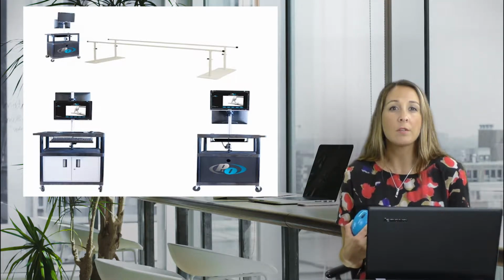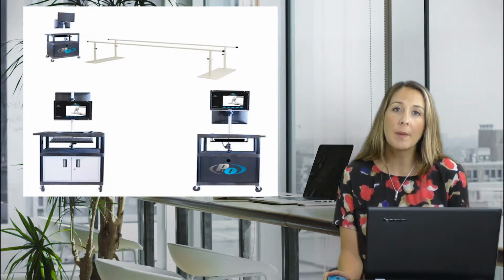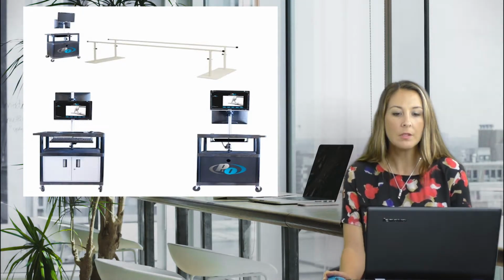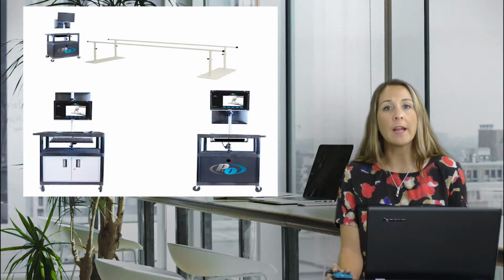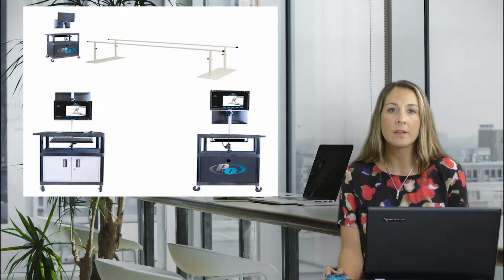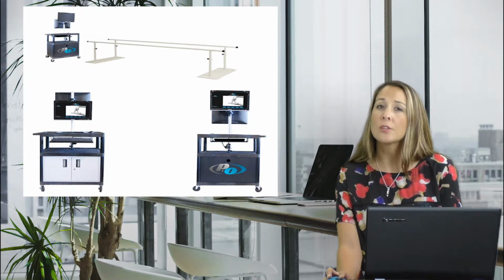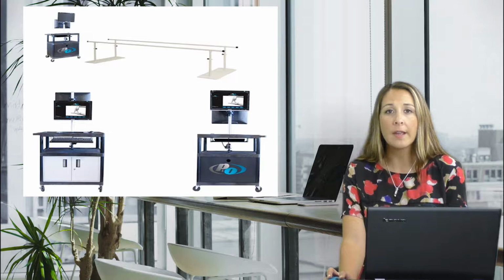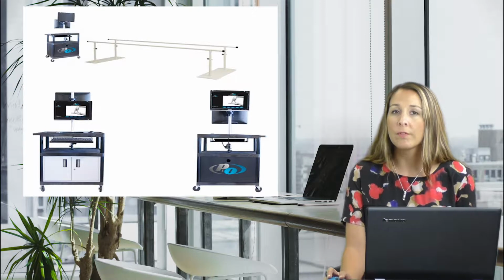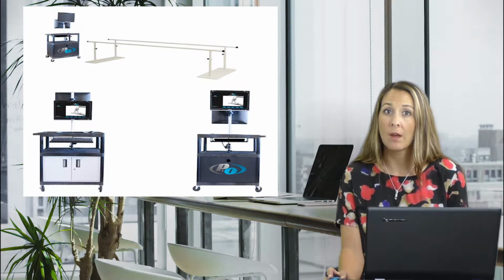So it's a really sophisticated way to capture video of patients that are coming in and out of your office. And the patient database helps you to quickly pull up any videos that may be associated with a patient. So if you're not sure exactly what equipment you already might have or that you might need, we'll help you. We provide a hardware source, and we provide the list of all the hardware that you need. So you can order the hardware yourself, and we'll help you get it all set up. We can do that remotely over the phone, or we can help you set it up in your office, of course, and then do some training with that as well.